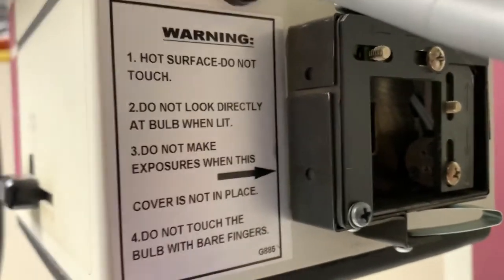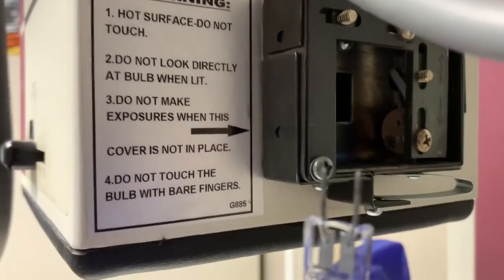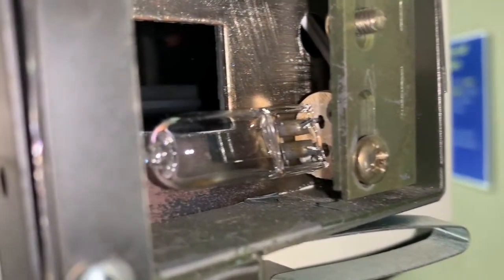Install the bulb by putting the two prongs into the holes in the socket. Make sure the bulb is pushed all the way in and sits level.